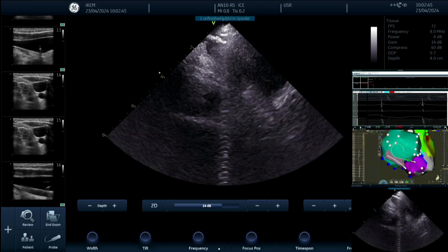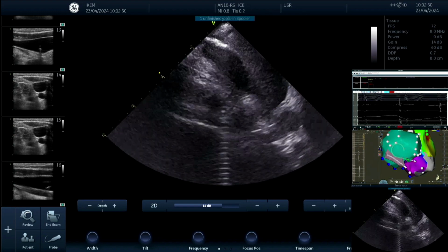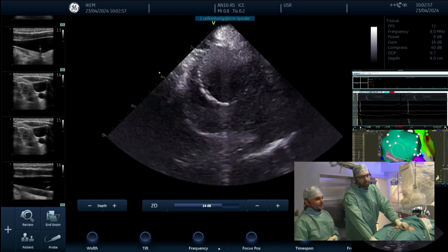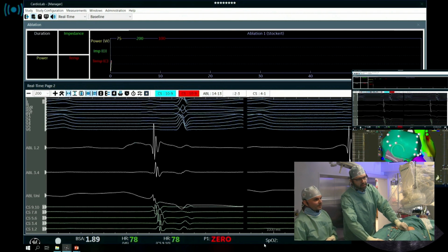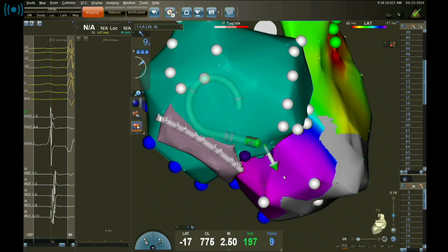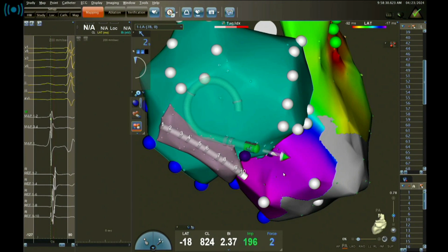It's more or less as described, between this fossa ovalis and the right inferior pulmonary vein. If you rotate more, you will see the right inferior pulmonary vein, which is a target, and if I rotate more, the PVI. This is right inferior and this is right superior. Usually when you see the pulmonary artery behind, it means that this is the superior vein and this is the inferior, and this is basically a skinny lady. We don't see ICE now. Yes, you don't see ICE. Sorry.